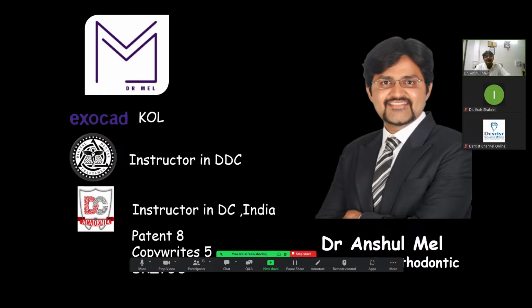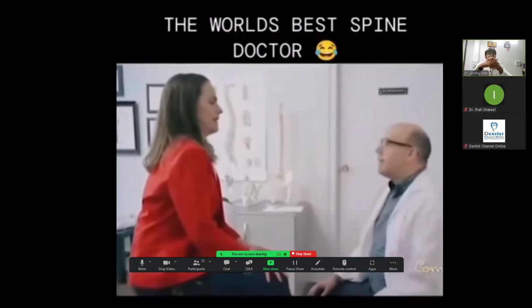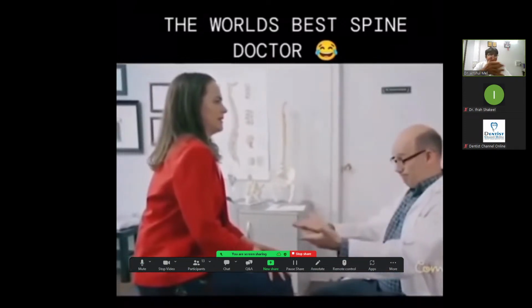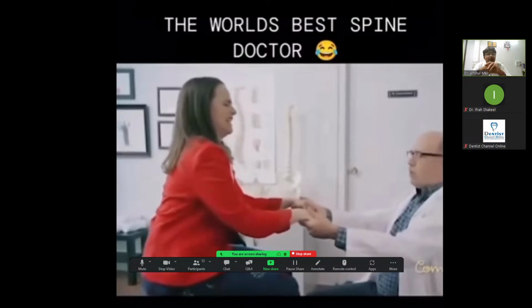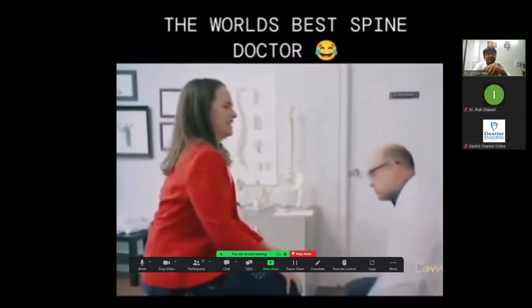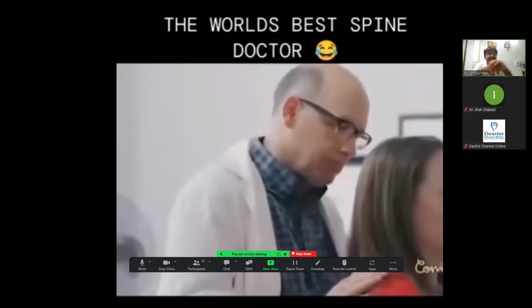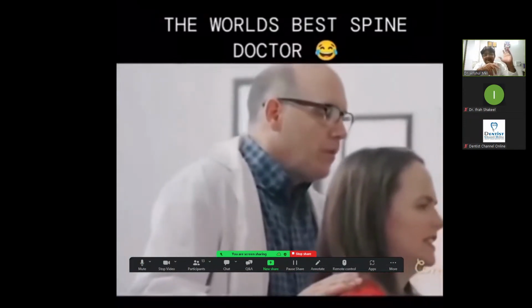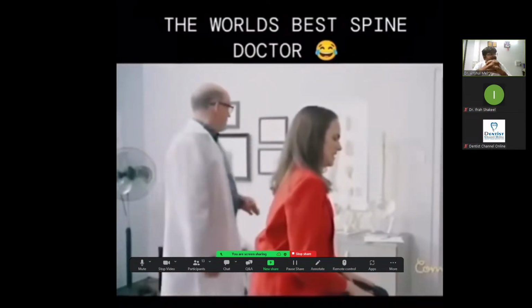I am Dr. Anshul, as the introduction already said, working in digital dentistry from 2014 onwards. If I ask any implantologist, if he placed the implant and after 1 month or 1.5 months the assistant tells him the implant patient is waiting outside, what is the feeling of the doctor?